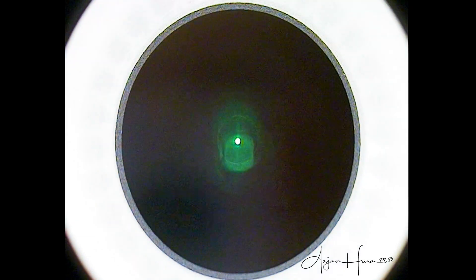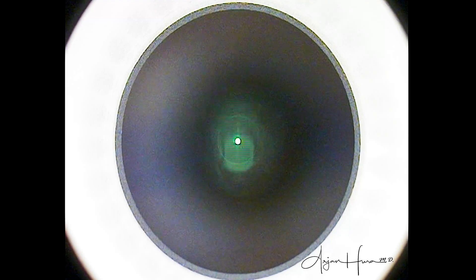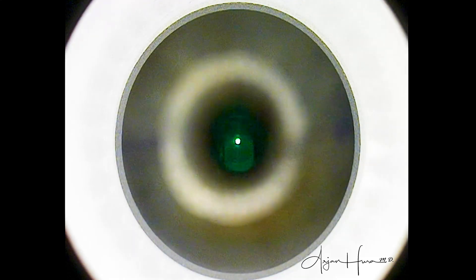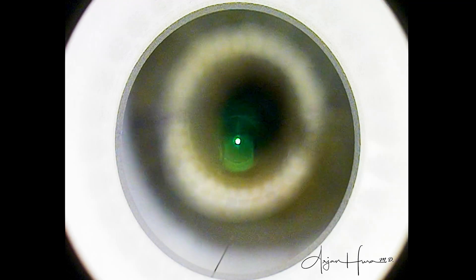Here we watch as the applanating glass cone of the Visumax laser is soon about to dock on the patient's cornea. Two critically important things have already happened up to this point. The first is I have already identified the patient's visual axis. For the SMILE surgery to be successful, the treatment needs to be centered on the patient's visual axis, which is not necessarily the patient's pupillary axis.